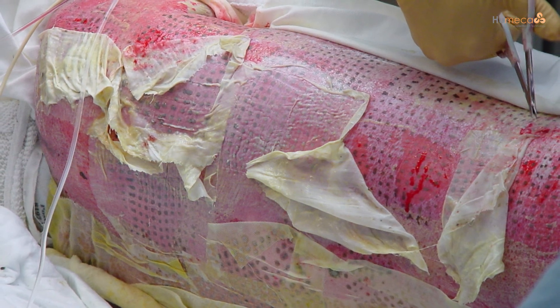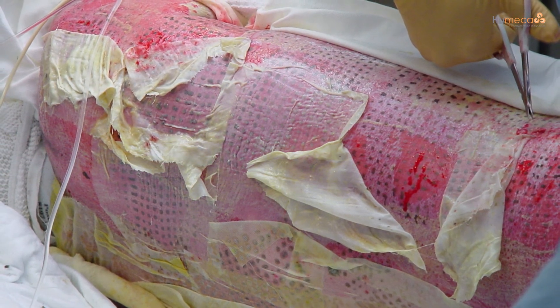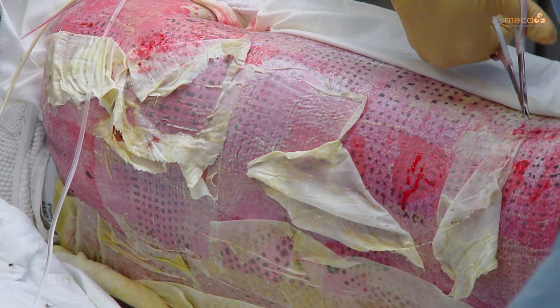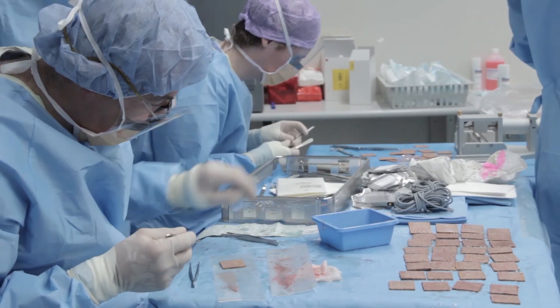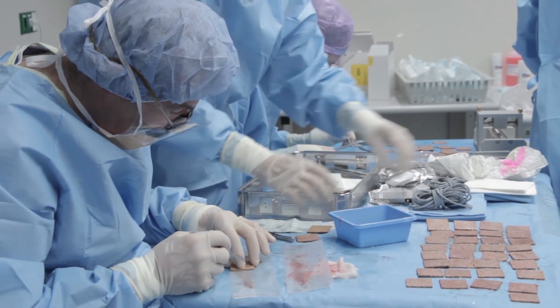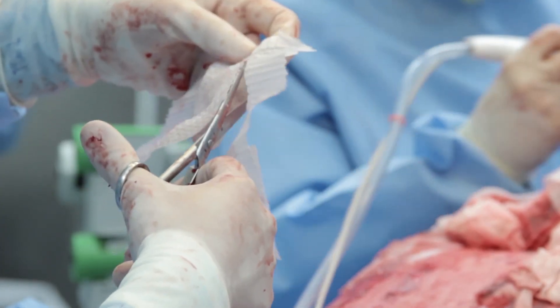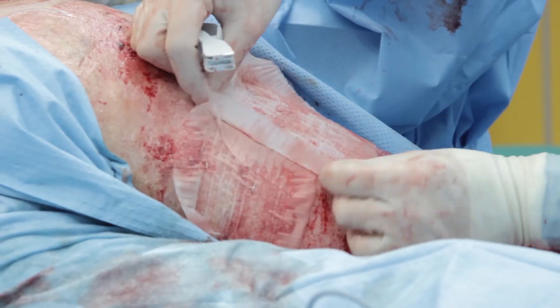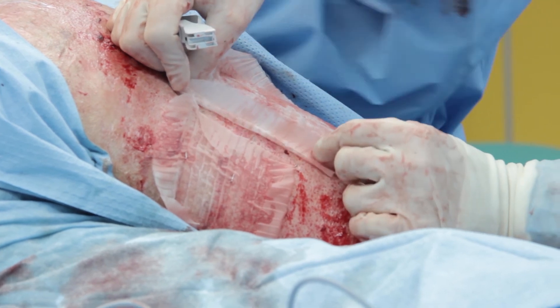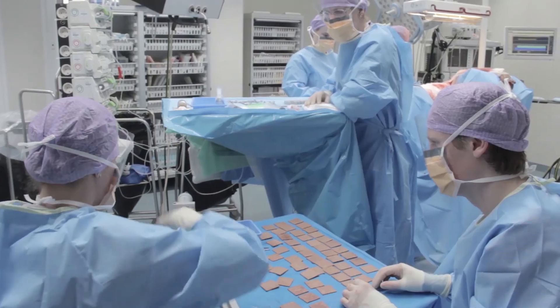Remove the staples and gently peel off the gauze fabric, leaving the graft islands in situ on the wound bed. It is no problem if removal is delayed after day six, as epithelialization continues. The Meek method is a practical and reliable technique for obtaining widely expanded autografts, especially in cases of extensive burns. It is considered the most efficient method for dealing with the patient's skin.